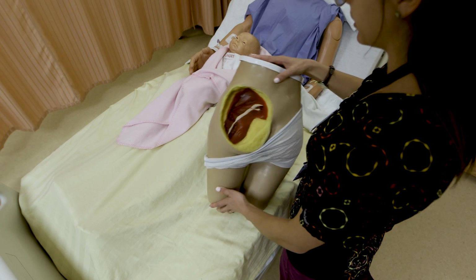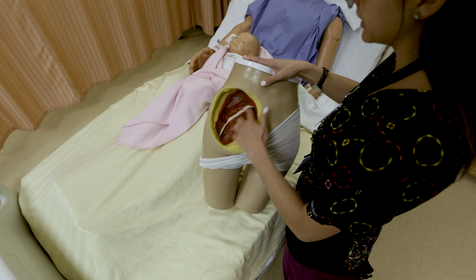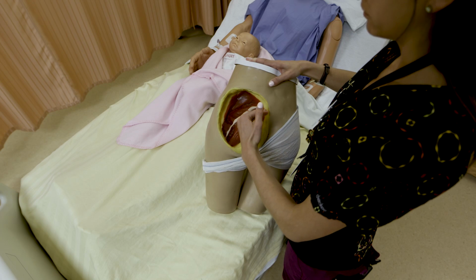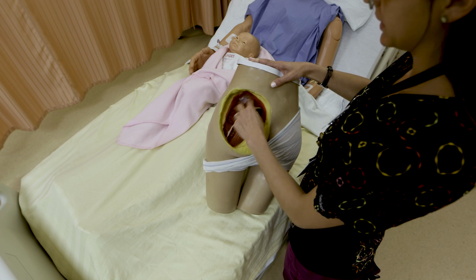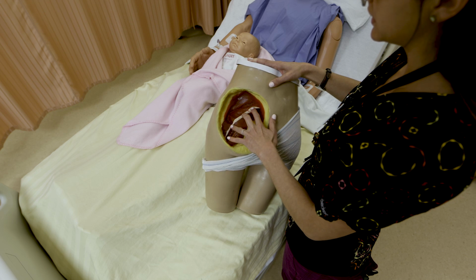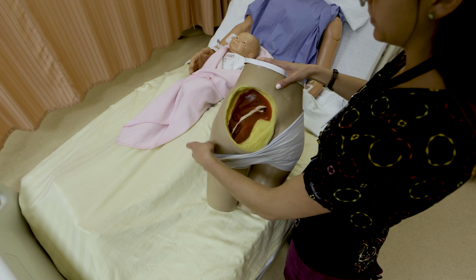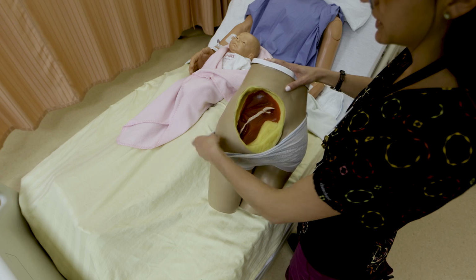I'll just take this opportunity to show you on this model. Its buttocks is cut out, so it's got the adipose tissue here and the muscle here. This is actually the sciatic nerve, and this is showing you how close you can get to the sciatic nerve. We were somewhere up here, so we were actually quite far away, but there was sort of a traditional or old school of thought that a dorsogluteal site, which is in this area, was an appropriate site. We don't do that anymore, so don't use the dorsogluteal site because you can see how close that does get to the sciatic nerve, so you increase the risk of complications with hitting that. Potentially can cause paralysis or lots of pain for your patient. So we just use the ventrogluteal, not dorsogluteal, and that's just a visual representation of why.